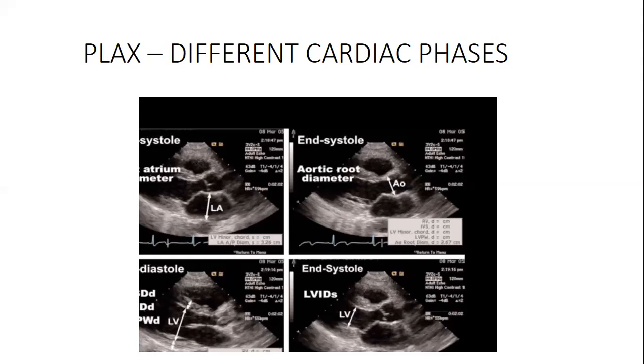Remember, the pulsed wave has got a short time; the pulses are sent in a very short time. That makes the pulsed wave not able to pick higher velocities. So when you increase the PRF, it will help the pulsed wave to measure a certain degree of velocities, not even just low, but it will enhance the pulse repetitive frequency.